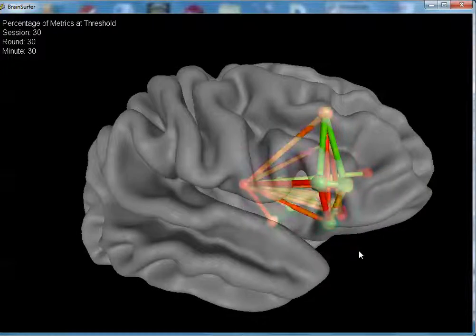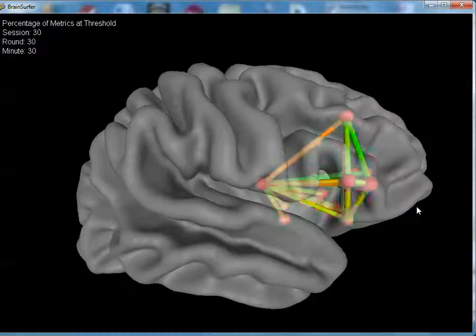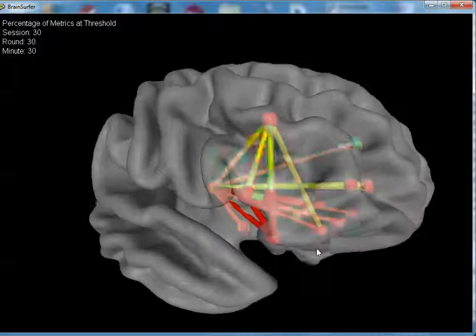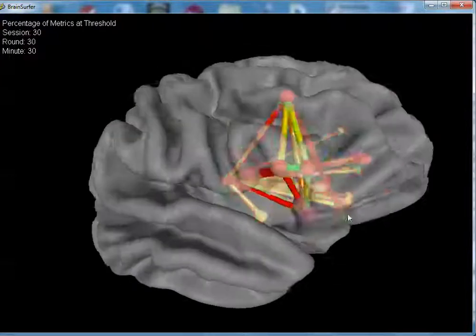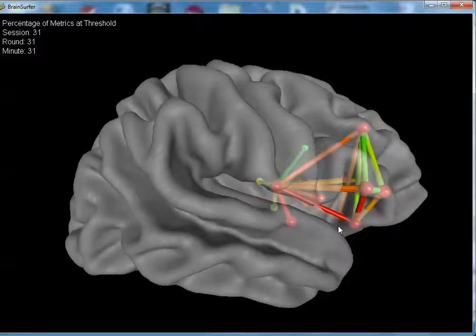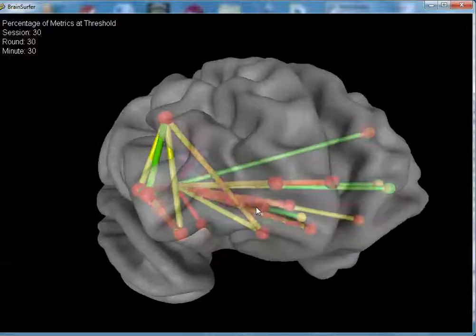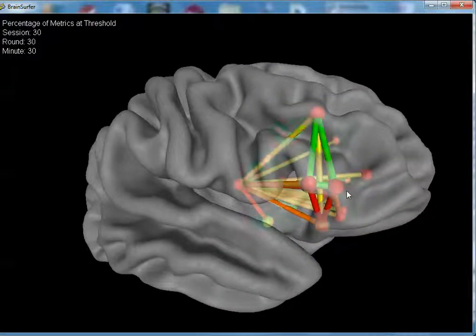The goal is to first assess the brain by using quantitative electroencephalography, or quantitative EEG, then reset the phase using high performance neurological methods with pulses that are time locked to the peak frequency of the EEG, followed by rewiring of the brain by training the individuals to make this network green, completely green.